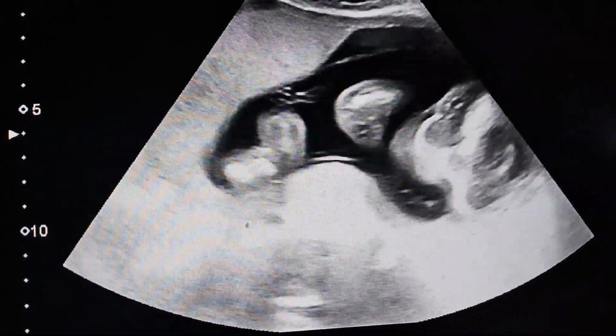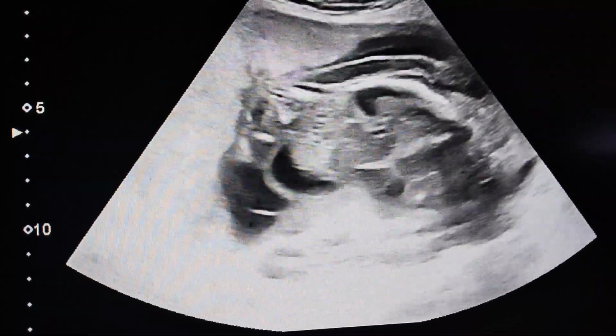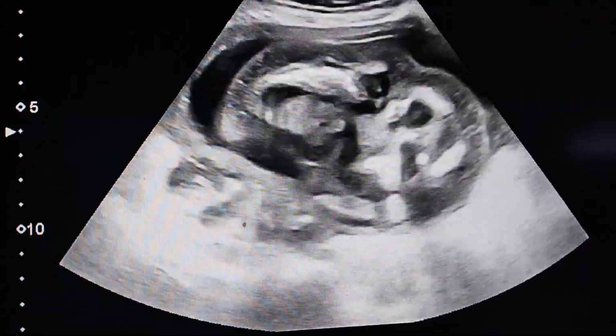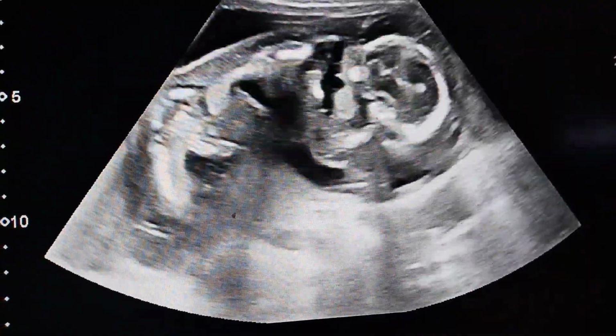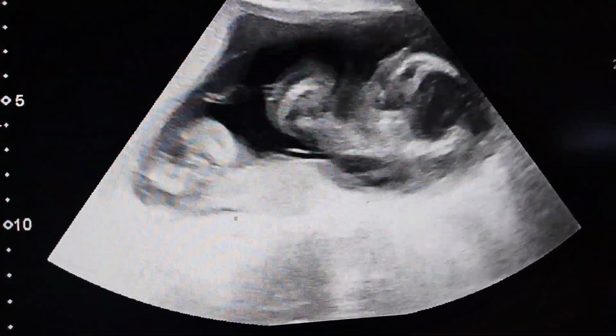But here sonographically we are unable to detect the thalassemia major. However, we can then go for the middle cerebral artery to see the anemia, in which the peak systolic velocity is increased.